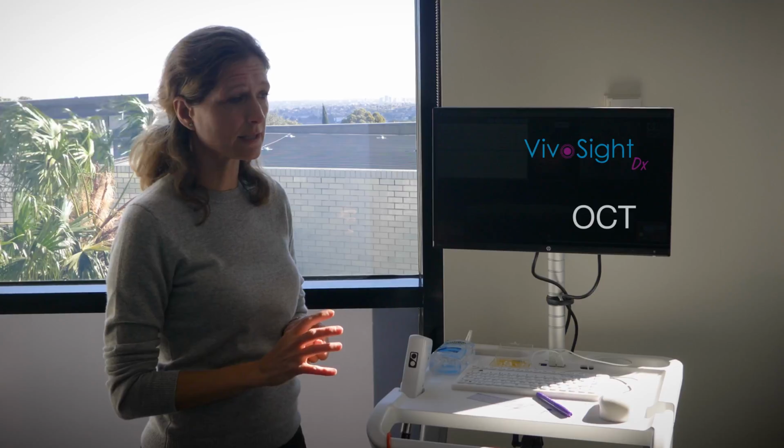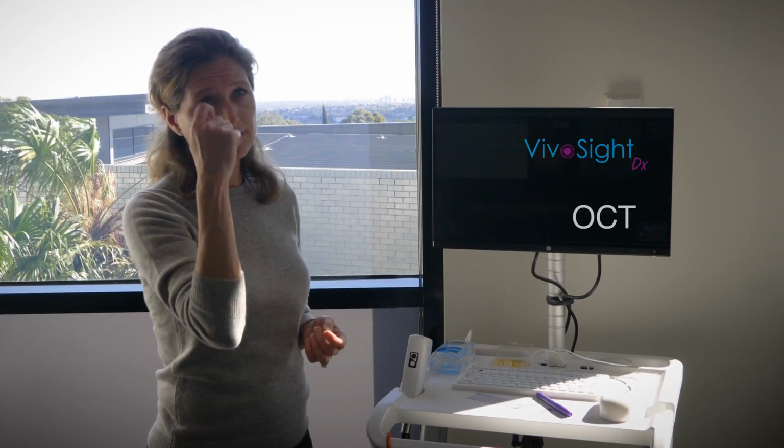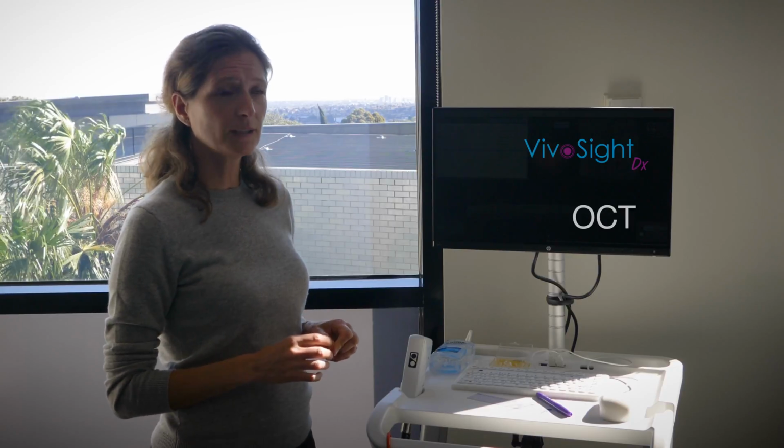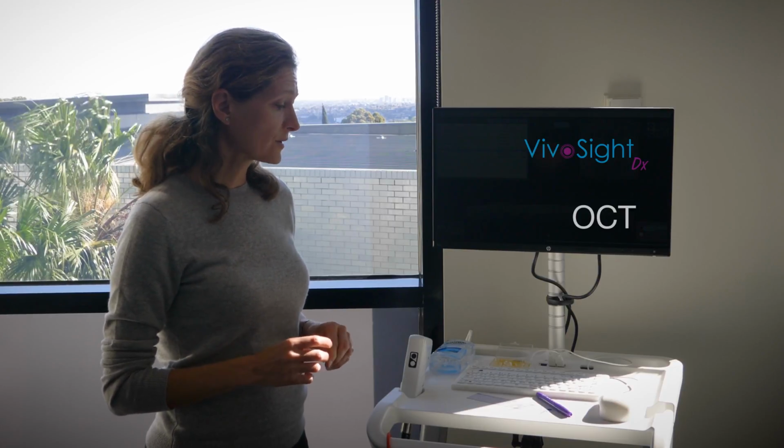Okay, so for plastic surgeons, could it be useful? I think so too, to have a look at what they're doing. I think plastic surgeons can also send to a referral center. So what we're doing at MIA is we have a lot of specialists sending patients here to have the scan, and then we draw on the skin and send them a photo of where to cut or where to put their radiotherapy field or that sort of thing. So it depends on their practice basically, if they see a lot of BCC or not.